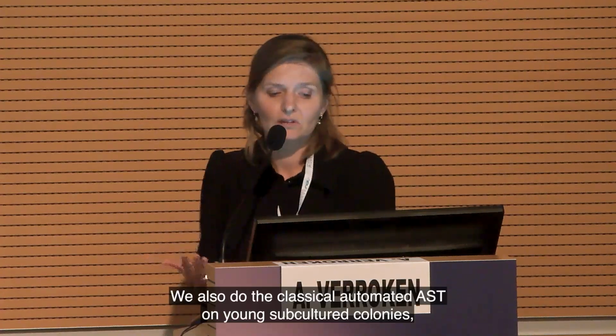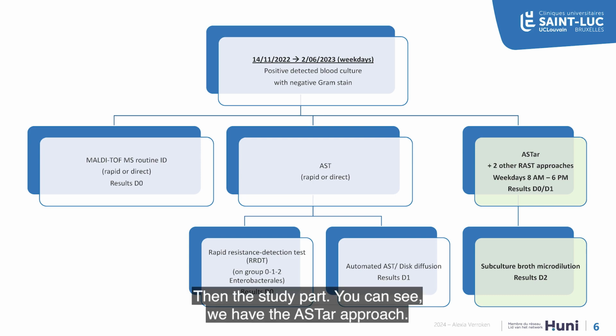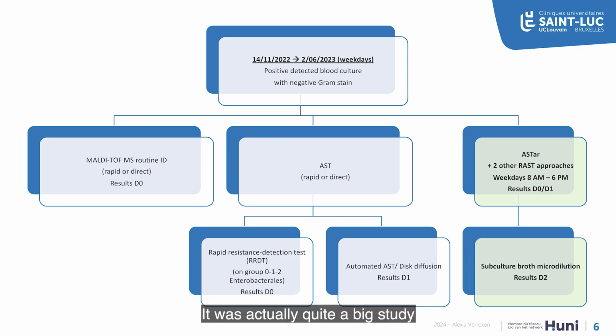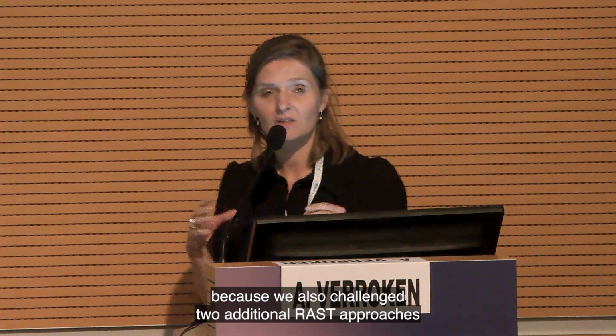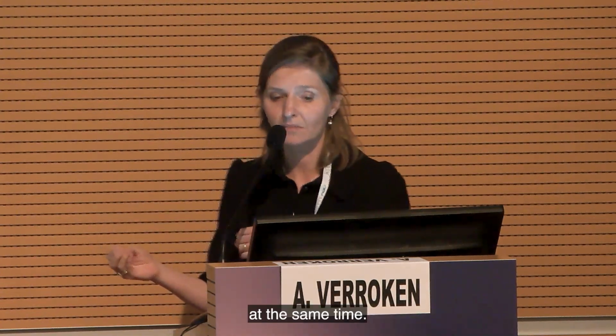And we also do the classical automated AST on young subcultured colonies, so we have the results the day after positive blood culture detection. And then the study part: you can see we have the ASTar approach. It was actually a quite big study because we also challenged 2 additional RAST approaches at the same time.